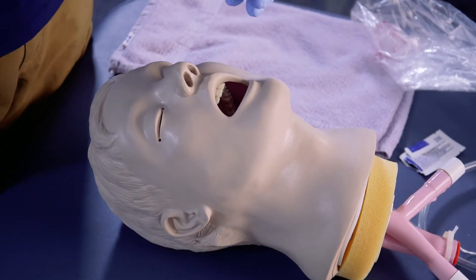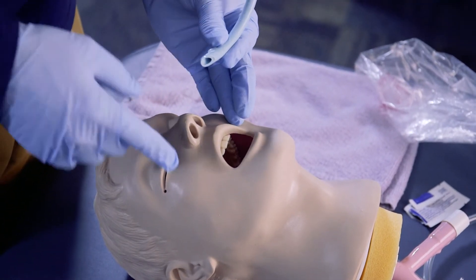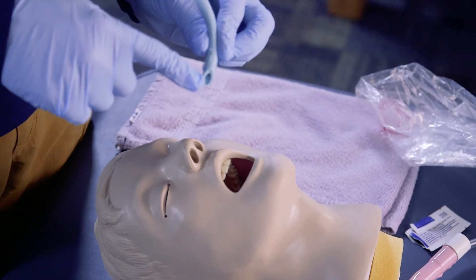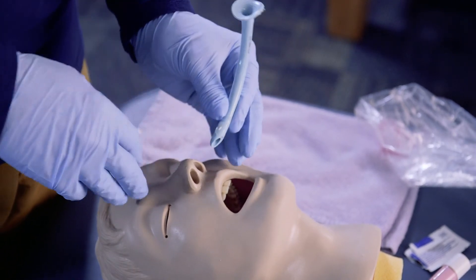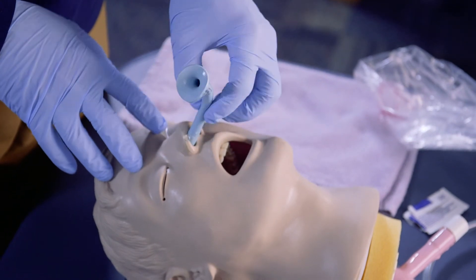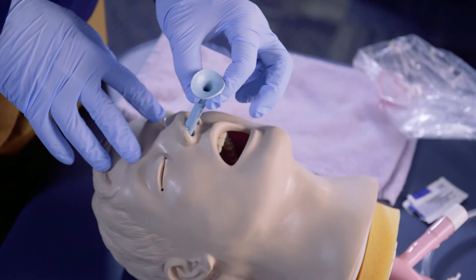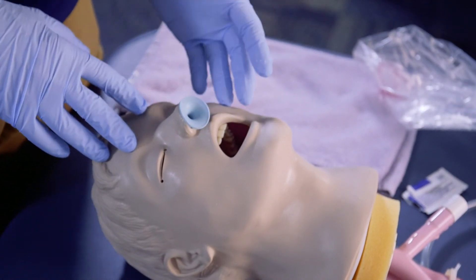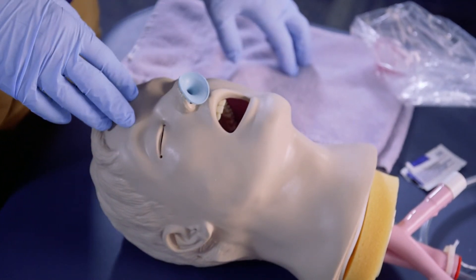Now that the end is lubricated, we can slide it into the nostril. It's generally recommended to go into the right nostril. We can see the beveled edge here — that's going to be facing up, with the back end facing up and back in. It slides directly into the nostril following the passage of the airway, and should slide in without major restriction, going right down into the back of the throat to create the airway.